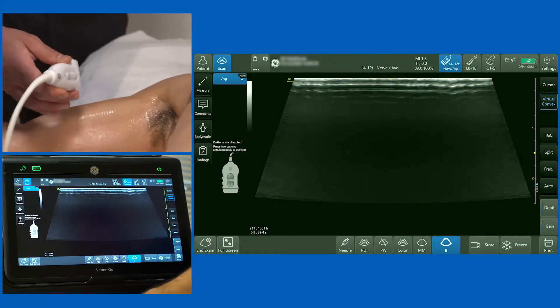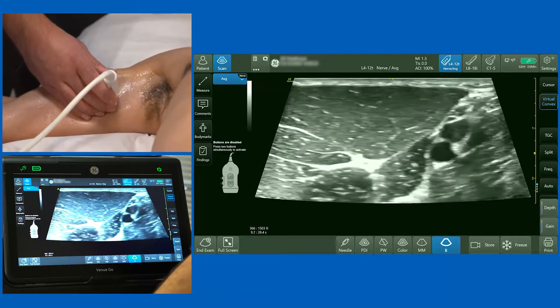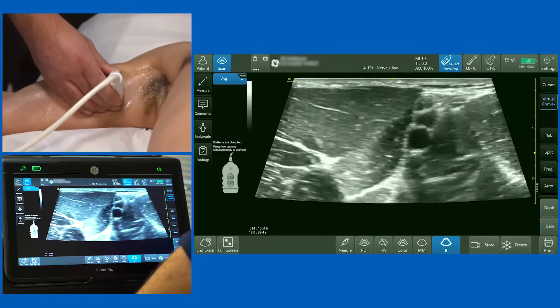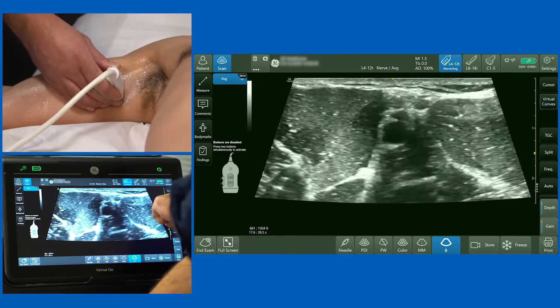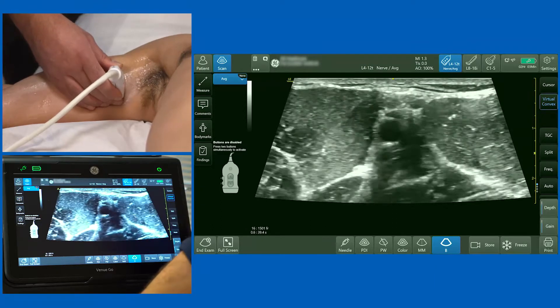We're going to move on to the axillary brachial plexus block, which is a great block for hand and forearm surgery and even surgery on the elbow. I'm going to use a high frequency linear probe. I've activated the virtual convex function, available on the right hand side of the screen, which just increases the field of view.